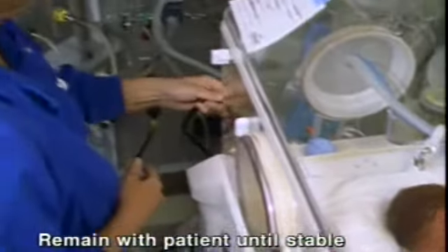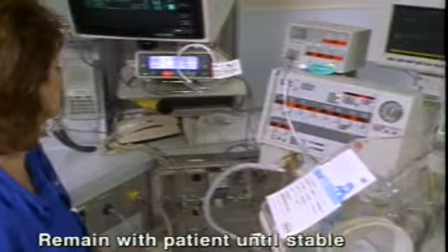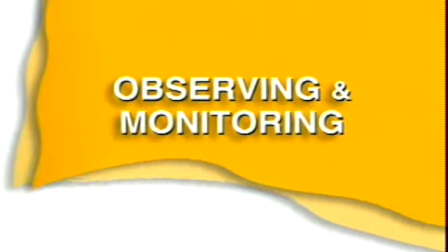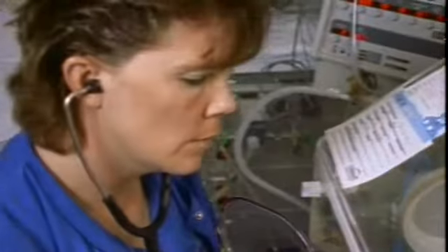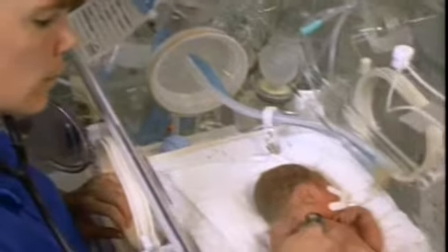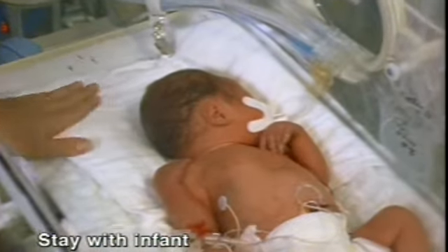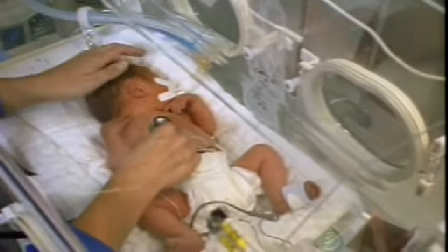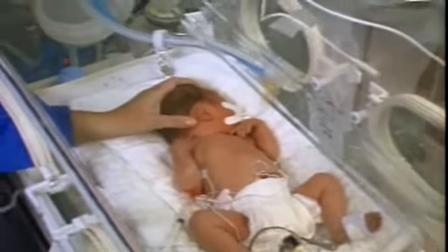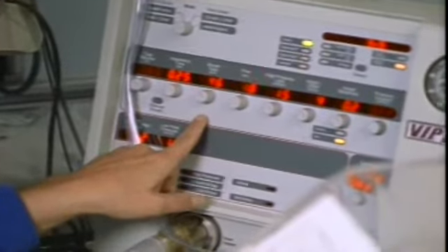After dosing, remain with the patient until stable. Change ventilator settings as compliance improves, or if you detect acute deterioration. Regardless of the strategy used, certain observation and monitoring procedures should be followed. Anticipate marked improvements in oxygenation and lung compliance within minutes of giving Surfactant. Stay with infants after dosing. Closely monitor oxygen status, airway pressure, and respiratory rate. When compliance or oxygenation improves, or if cyanosis or bradycardia occurs, adjust the ventilator appropriately.